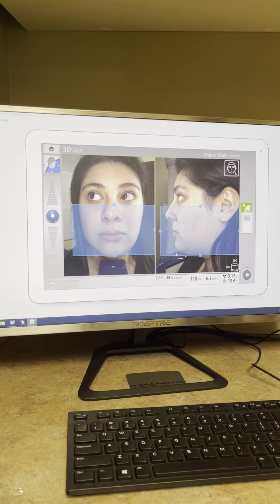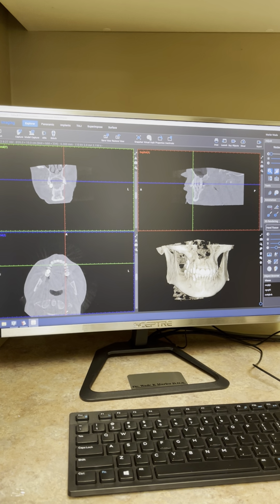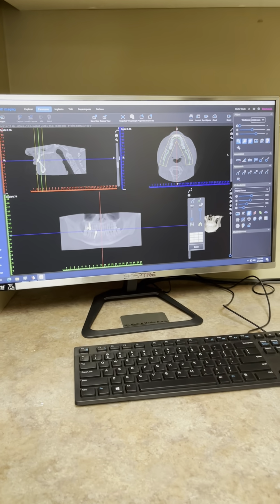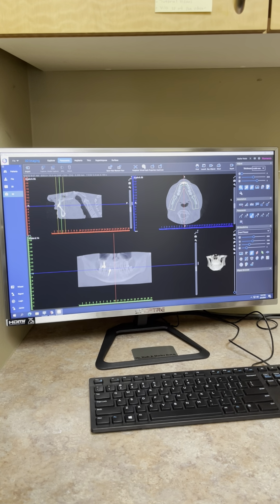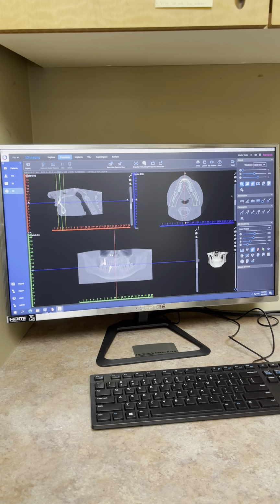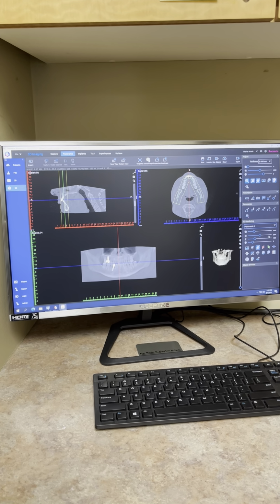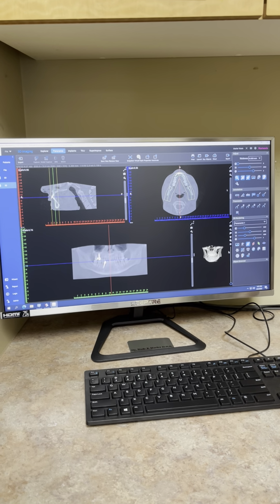Once the 3D is captured, we know that this is what appears. You're going to click your panoramic tab. You're going to widen your focal trough. Make sure everything looks good in here. If you need to slightly adjust any of this, what matters is that all of this data is in here. If you can see the full panoramic spread, you know you're going to get it. 3D, MIP, black and white, hard tissue to panoramic 1, soften it with that. And then crosshairs are off and capture.